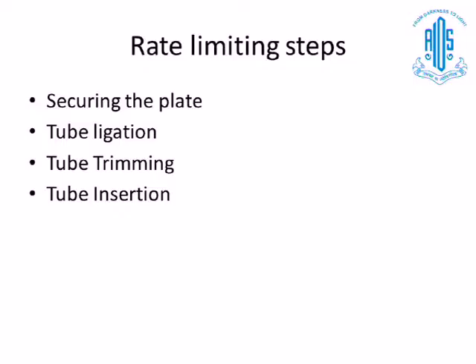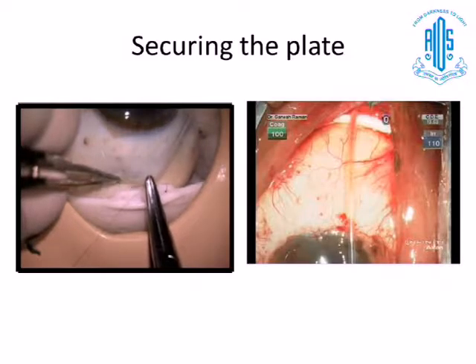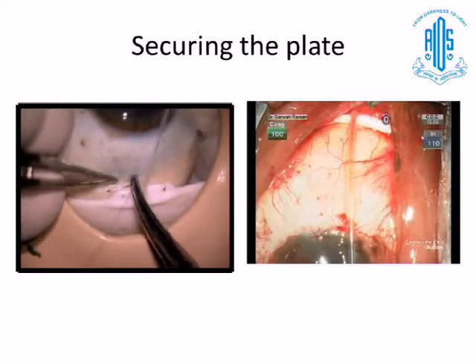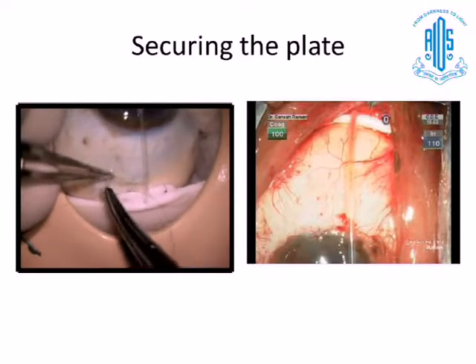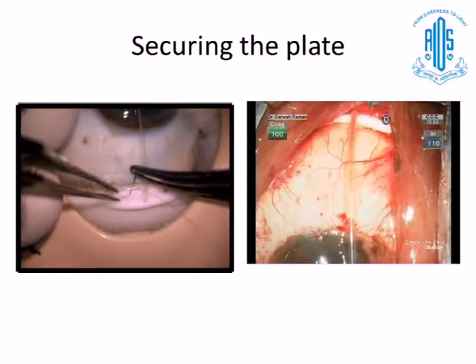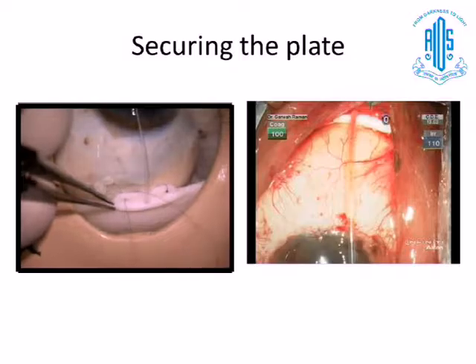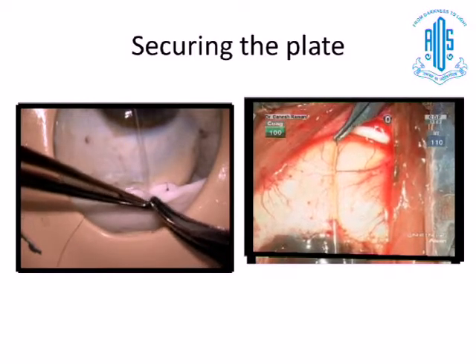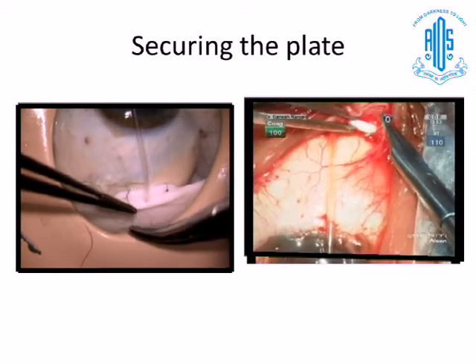This is a video showing securing the plate in the wet lab under the microscope. You find that the surgeon is very comfortable, taking his own time to pass the suture through the sclera, using a very nice technique of reversing the suture so that the pointer doesn't come through the eye of the plate — this is a very safe technique. Whereas if you see a person with less experience doing that, there is a lot of hesitation, and somebody has to guide the surgeon, so it takes more time.